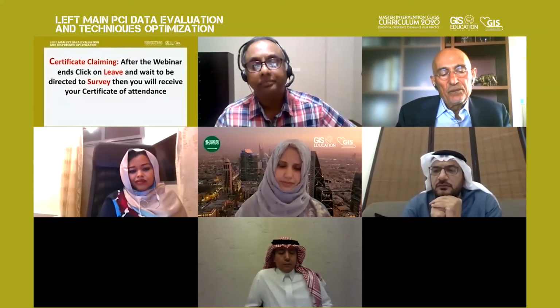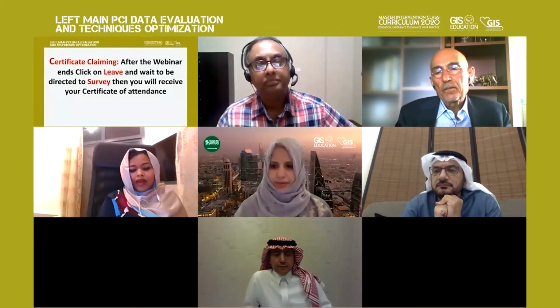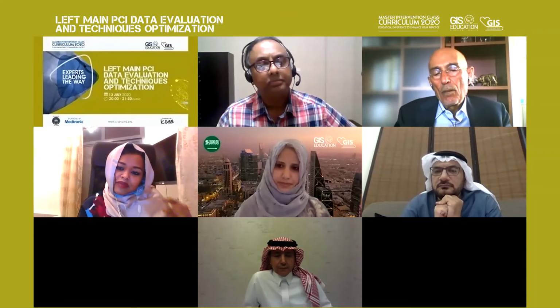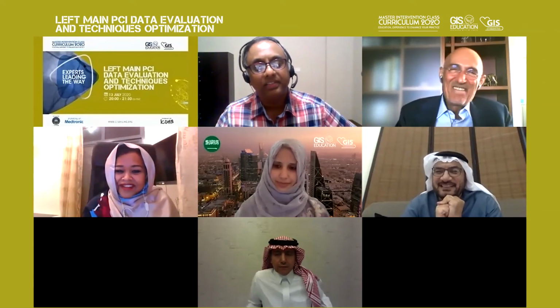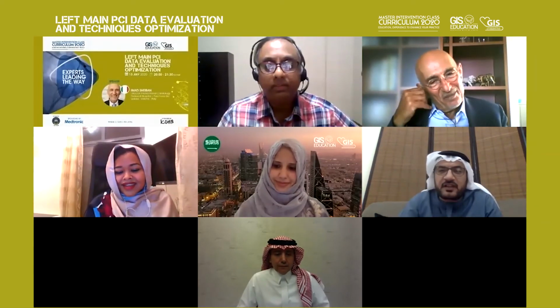Dr. Asima, Dr. Mervet, please. I think one question I had is, after you did the case the first time, did you FFR the LAD? Do you have FFR? No, we didn't. We have FFR, but I didn't FFR the LAD. Okay. It's interesting, when you do FFR, even if it's beyond 50%, you get them very normal. Most of the time they are normal. But anyway, I think that's interesting to do.